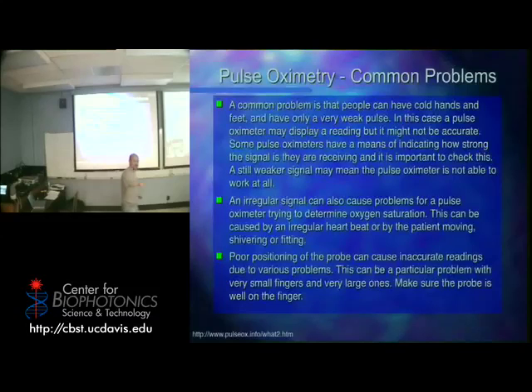What if you're moving and you want to get a reading? It's hard, right? You're moving. The light's moving. This thing's moving on your finger, okay? Now you guys laugh, but that's why they have to make special units for athletes, right? How can athletes monitor this while they're running at top speed or swimming or doing all these other things? They have to create a device that would be consistent enough to get a reading.